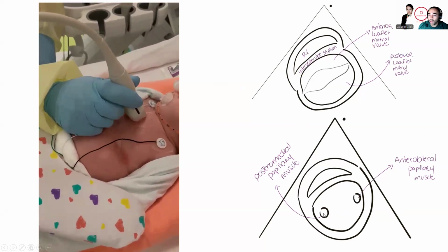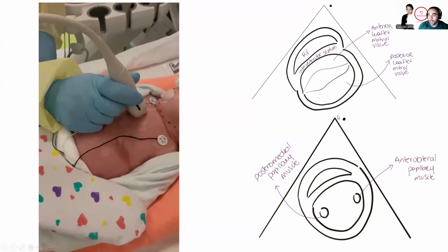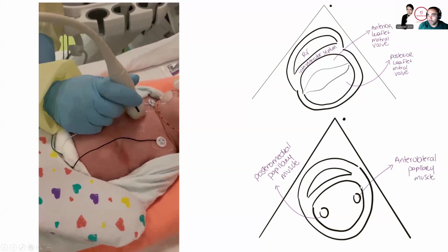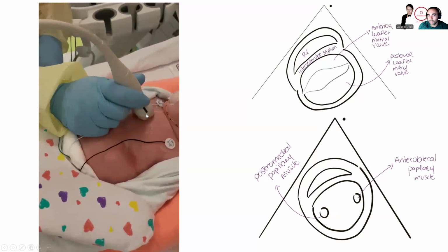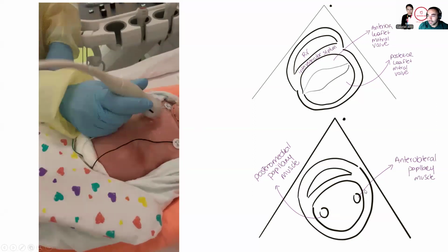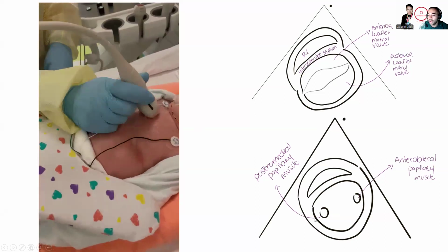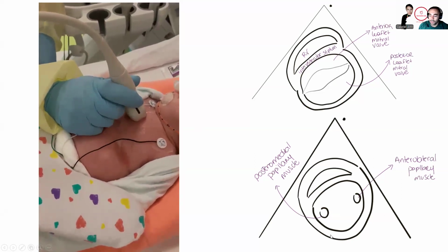Why medial? Because the sternum is here. And so as you're getting closer to this side, you get closer to the medial side of the body. And as you're going towards the marker, you're going more to the lateral side of the body. If you see, the marker is oriented towards the lateral side of the body and towards the left side of the body. So this is the left part of the left ventricle, and this is the right part of the right ventricle, and this is the right ventricle. Or I should say more posterior or inferior part of the left ventricle to be fully truthful.